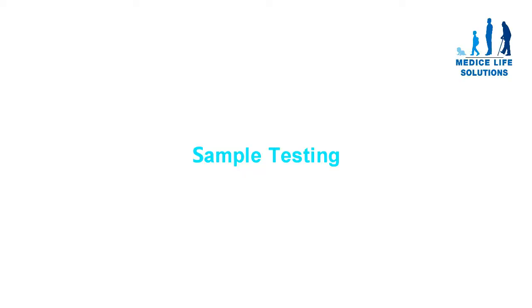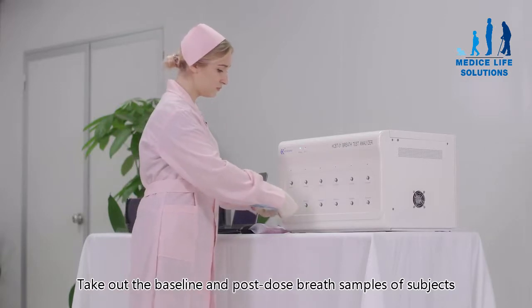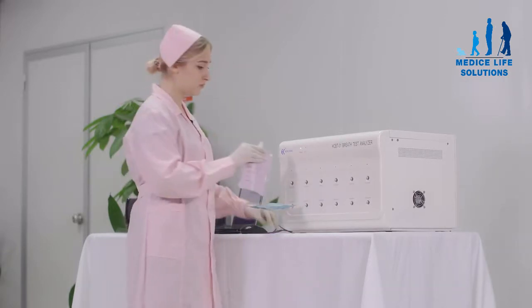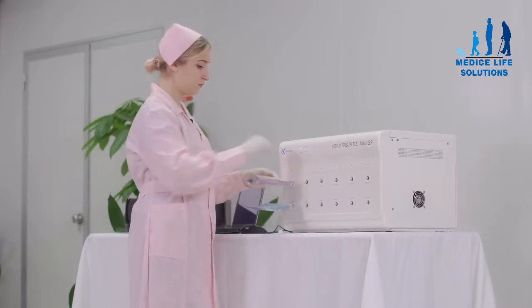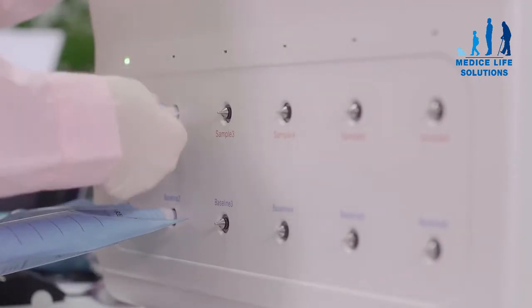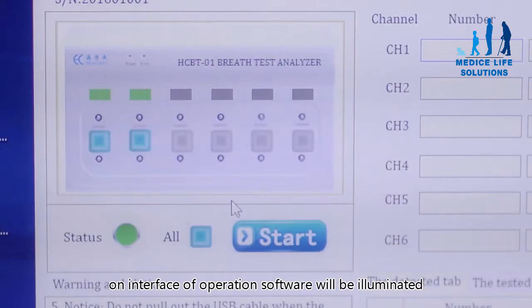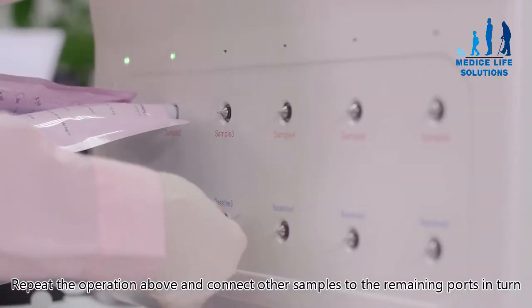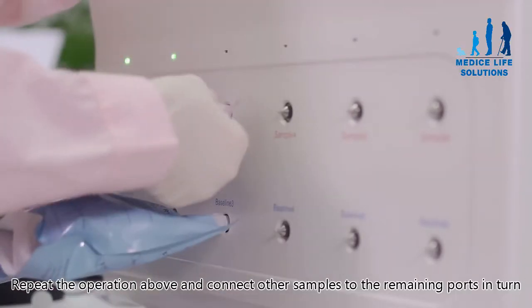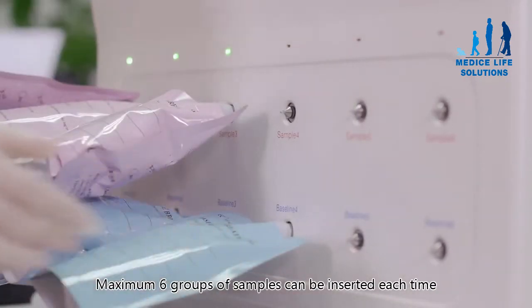For sample testing, take out the baseline and post-dose breath samples and connect them to the appropriate ports. When delivered correctly, both the port indicator and the status indicator on the interface of the operation software will be illuminated. Repeat the operation and connect other samples to the remaining ports in turn. A maximum of six groups of samples can be inserted each time.